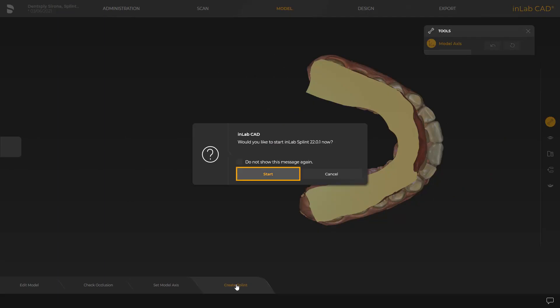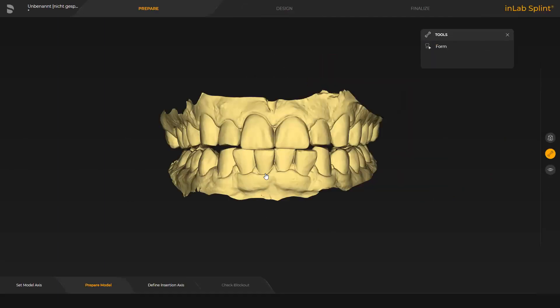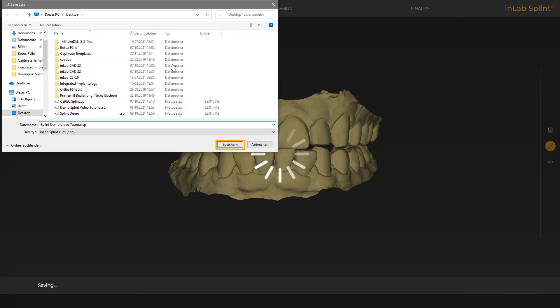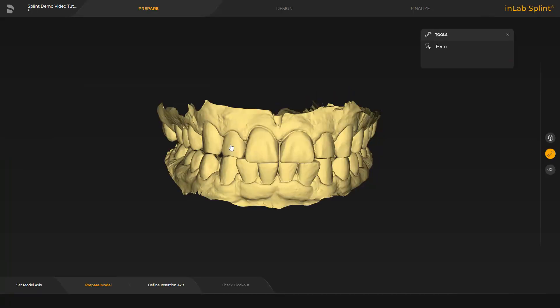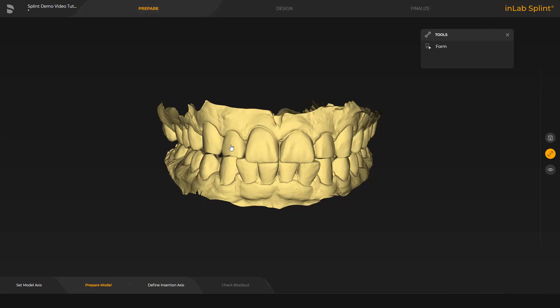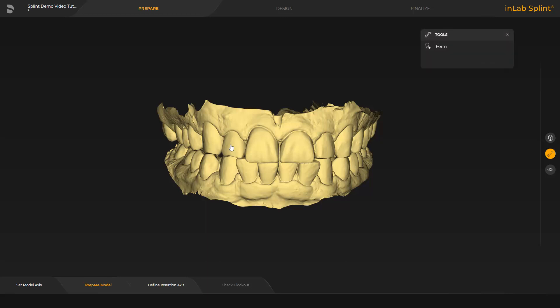We confirm by tapping Start and the case will open in the Splint app automatically. First, we tap the Dentsply Sirona icon in the upper left corner and save the case. In the Splint app there are three phases. We start in the Prepare phase with the Prepare Model step. In this step, material can be added, removed, or smoothed with the Form tool.